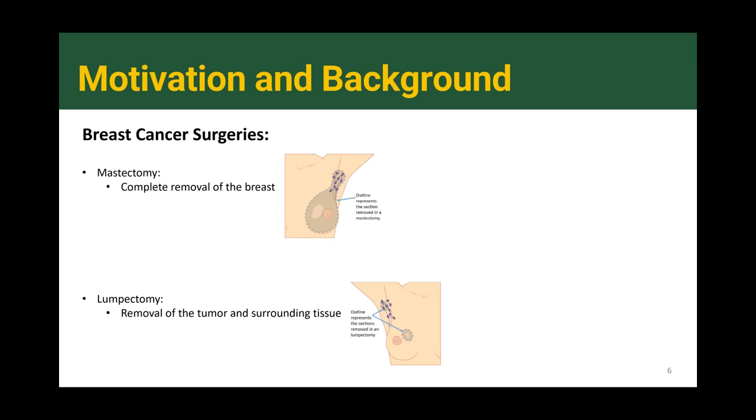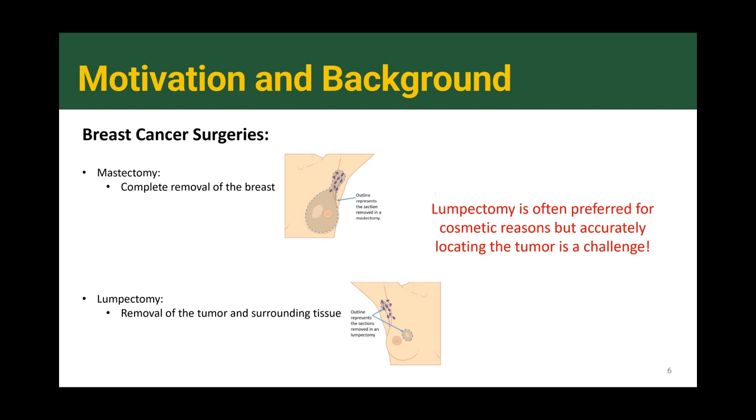So lumpectomy is often preferred because of cosmetic reasons, but the challenge is to accurately locate the tumor, because if the surgeon wants to cut the breast and in the surgery take the tumor out, there needs to be a precise localization of where the tumor is.